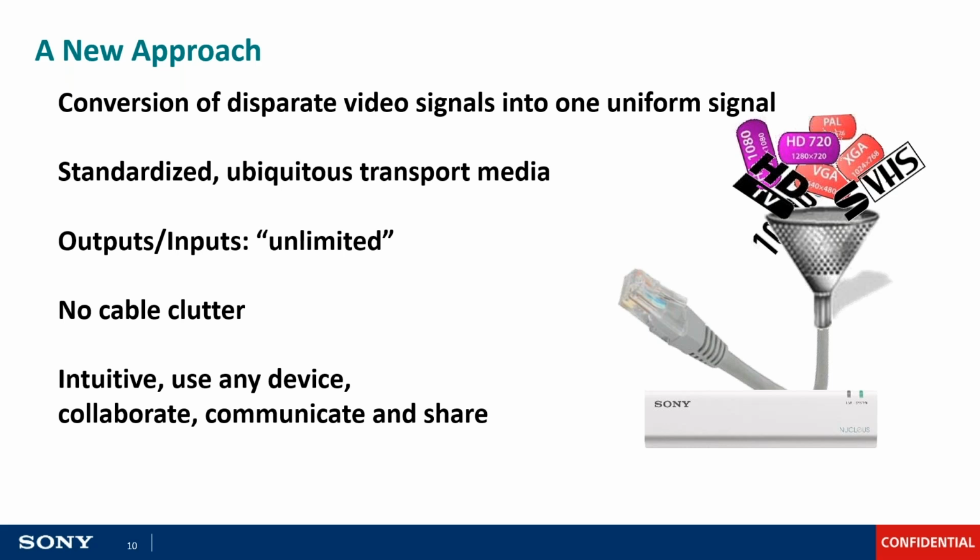The cabling is very inexpensive. Biomed stocks different lengths of RJ45, so if they do get run over, it's very inexpensive and very easy to replace that single connector or cable, instead of having to search for a specific cable and have sizes of cables that are too long for what you need it for.